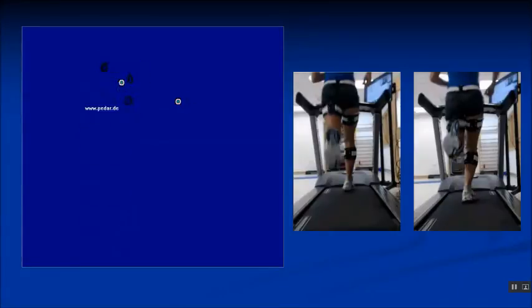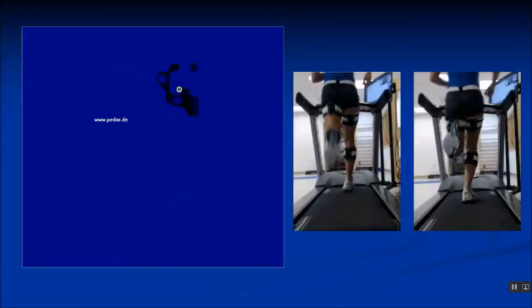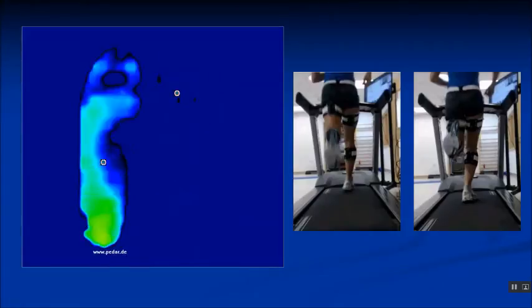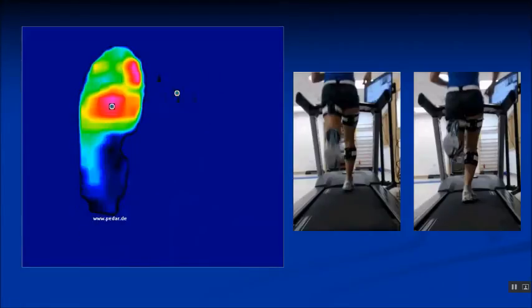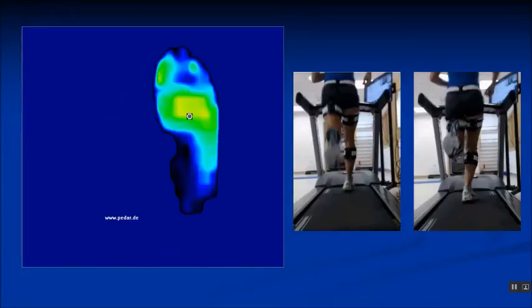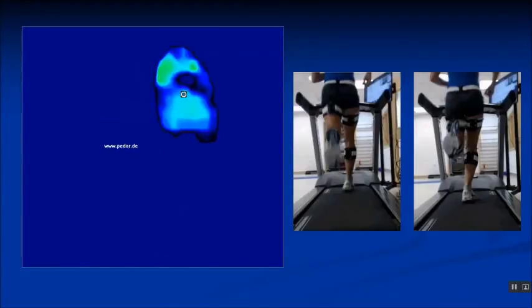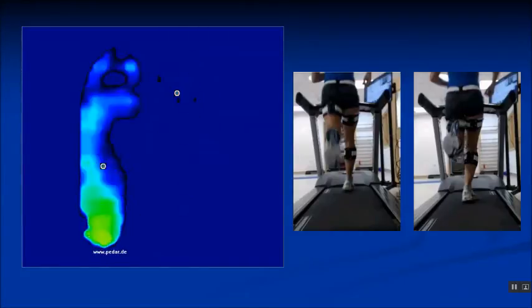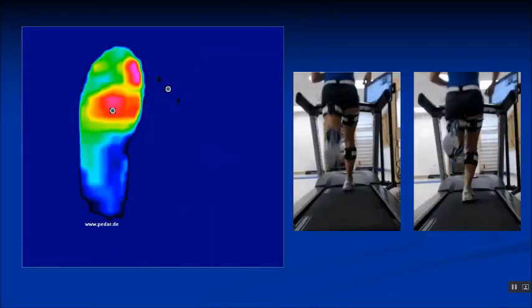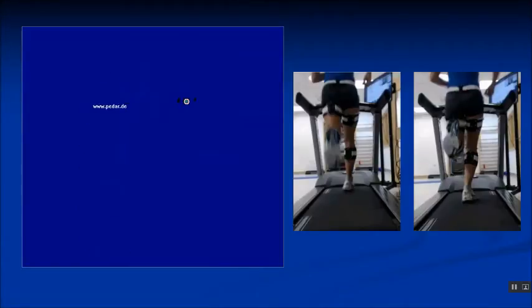Now let's look at the in-shoe analysis. On the right side you will note that there is no heel contact. We have heel contact on the left and a forefoot strike on the right, but despite the shoe looking as though there is rear foot contact, there is no rear foot contact. This is a completely asymmetrical gait and loading pattern.